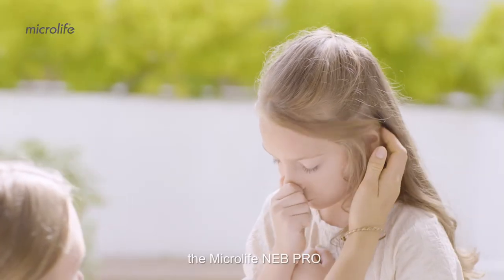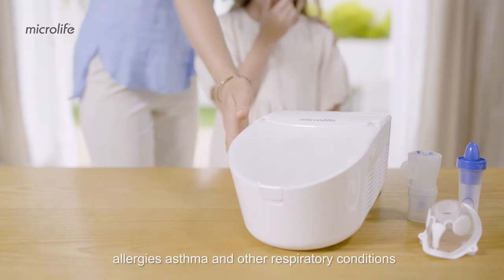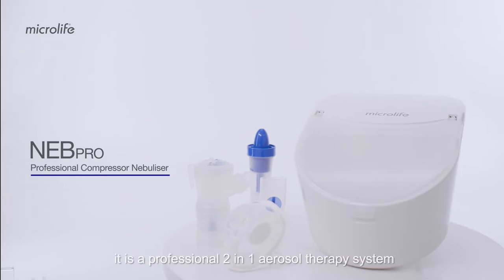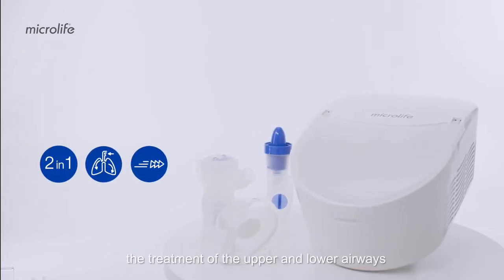The Microlife NEB Pro is a high-performance system to treat colds, allergies, asthma, and other respiratory conditions. It's a professional 2-in-1 aerosol therapy system for the treatment of the upper and lower airways.